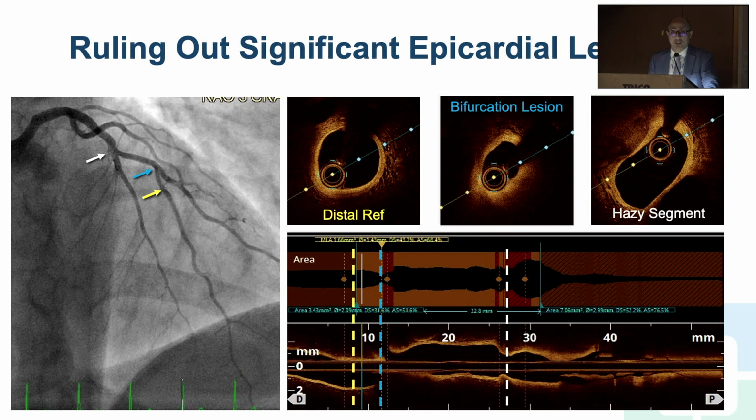So this patient actually has epicardial disease, and her non-STEMI was caused by an obstructive lesion, just like everybody else, except that it just wasn't as clear on the angiogram. And so this patient was considered for a mammary bypass or for stenting, and ended up getting one long stent to cover that segment.